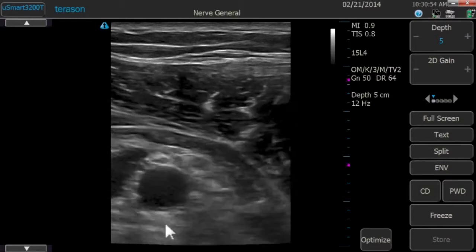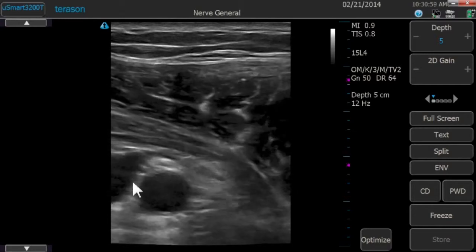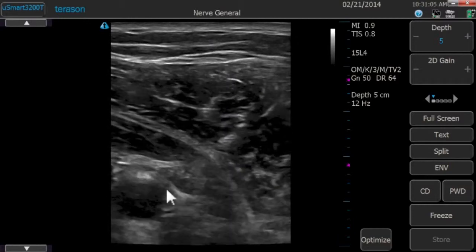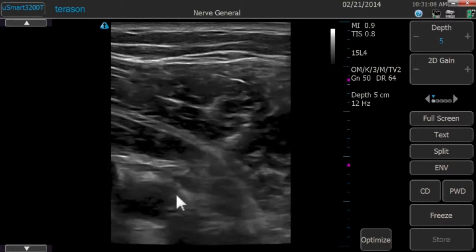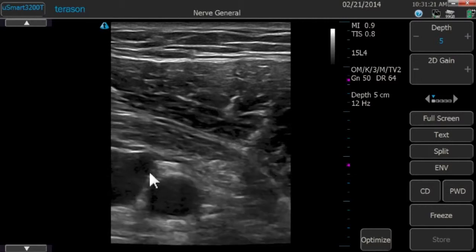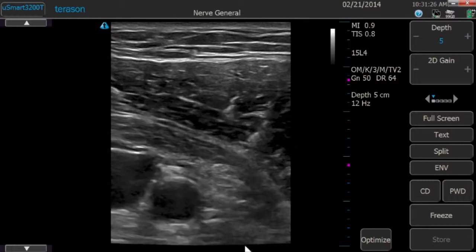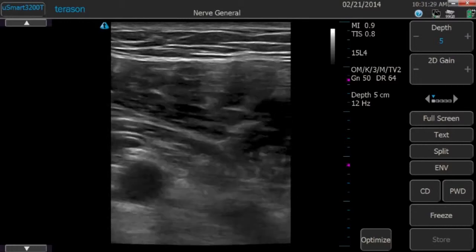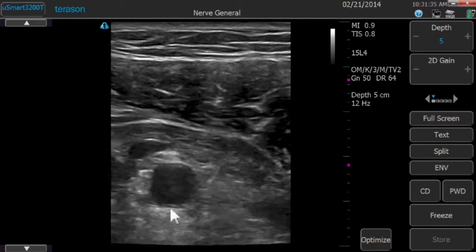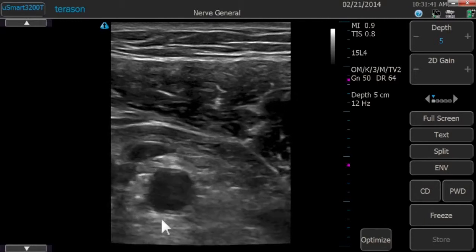We're going to be targeting three primary nerve structures with this nerve block — the three cords. The posterior cord lies at about six o'clock relative to the artery. The lateral cord typically lies at around one, two, or three o'clock relative to the artery. The medial cord — usually the hardest to see — is somewhere on the medial side of the artery, between about nine o'clock and eleven o'clock. The most important starting point is just above that posterior cord at the six o'clock position, and there's plenty of evidence supporting a single injection at that location.